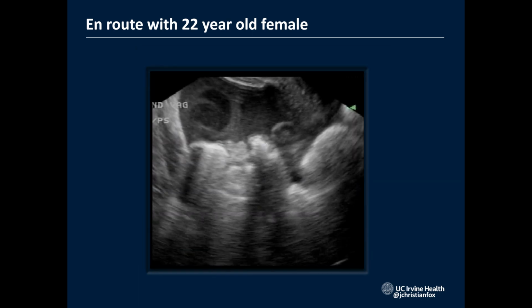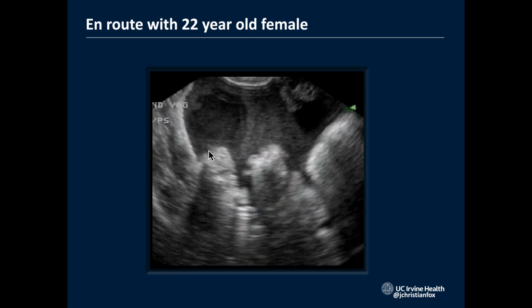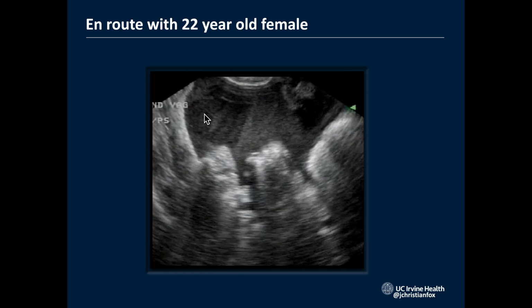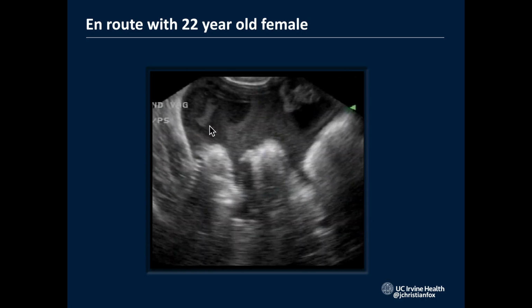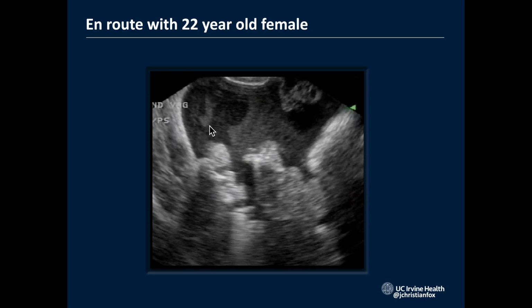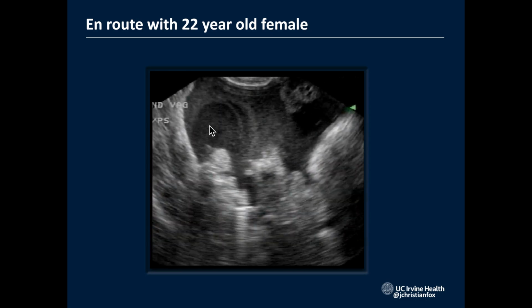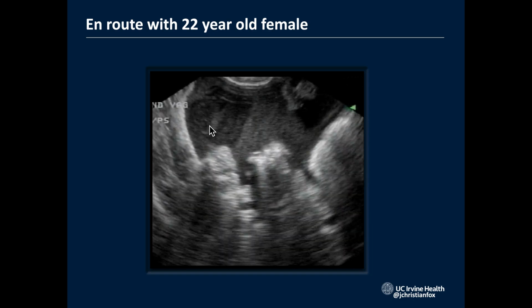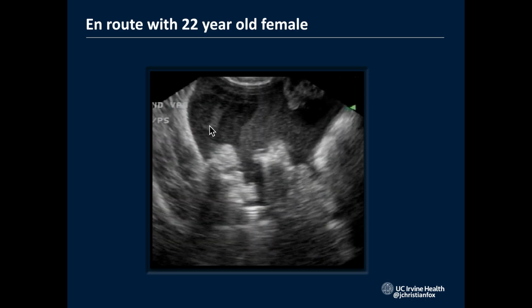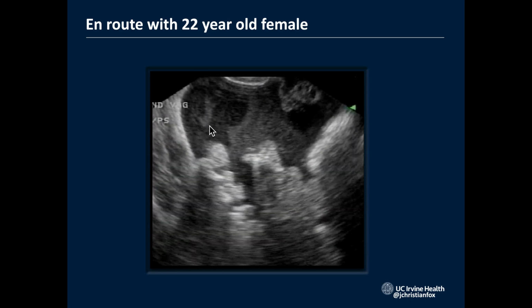So we did this ultrasound in her pelvis, and we can see actual blood extravasating in her pelvis right here, just swirling around from a ruptured ectopic pregnancy. We don't even have a pregnancy test back, but we think she has a ruptured ectopic pregnancy because she's young, she's female, she's coding, and she's got blood swirling around in her pelvis. And so we call OBGYN, we hang blood, and she goes to the operating room, and she survives.